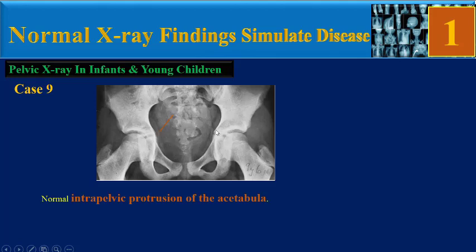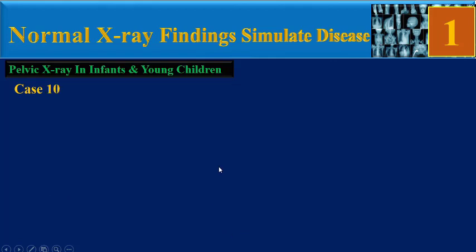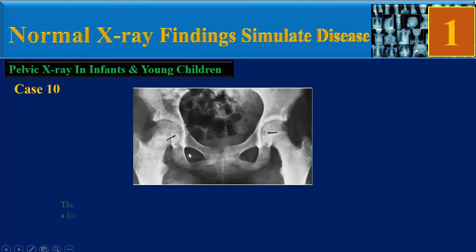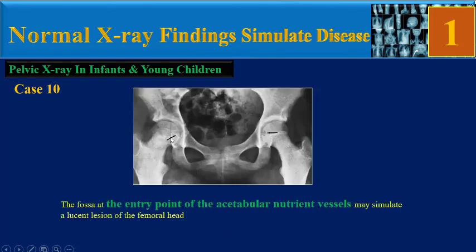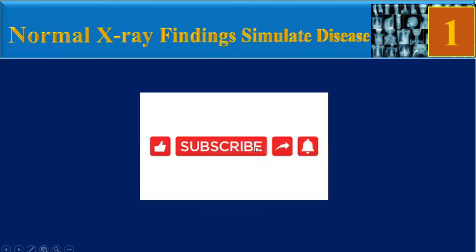Case 9: normal intrapelvic protrusion of the acetabula. This is a normal phase of development between 4 and 12 years of age. In the last case, the fossa at the entry point of the acetabular nutrient vessels may simulate a lucent lesion of the femoral head.